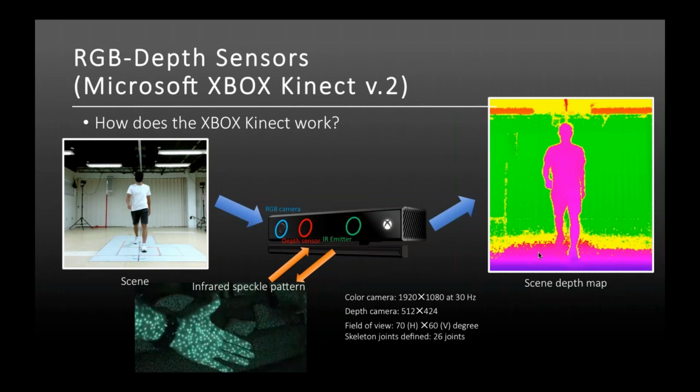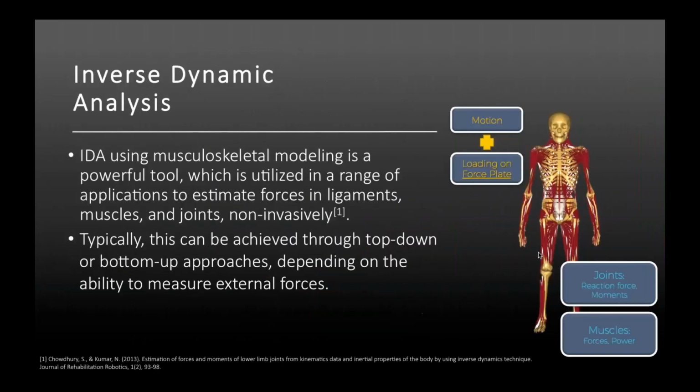So while walking in front of the sensor, in addition to the 2D picture, you get the 3D or depth information using the infrared map, if you will, or pattern. And as Morten mentioned briefly, this is for the kinematic part, right? How we're going to hopefully have an alternative to capture the patient's movement first, without the use of markers, and keeping in mind a cost-effective alternative that can be used in a clinical setting.